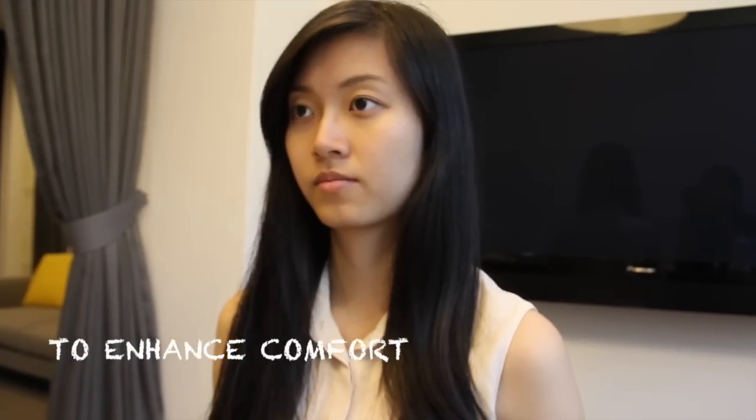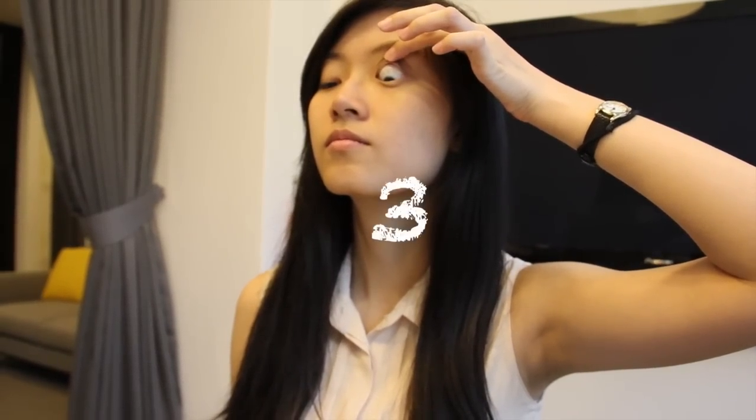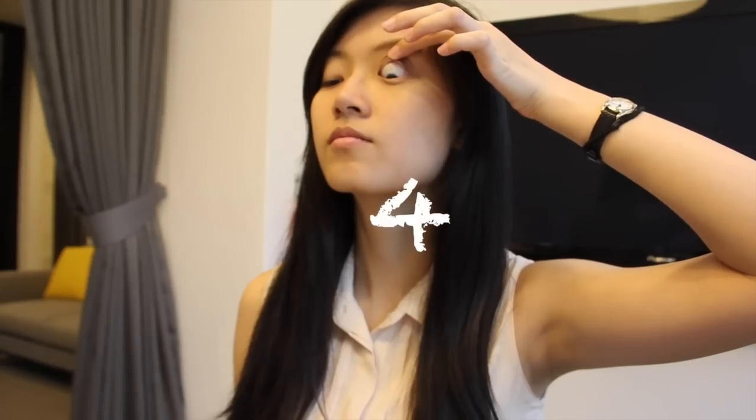After insertion, to enhance comfort, you can tilt your chin up and look down to the ground. You can also lift your upper lid for five seconds and slowly release it.